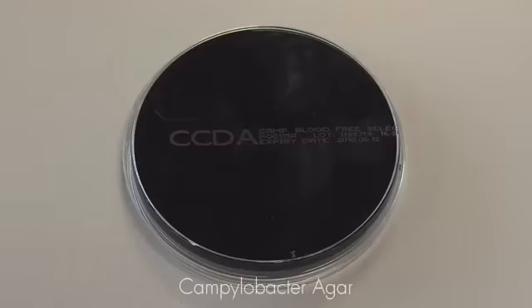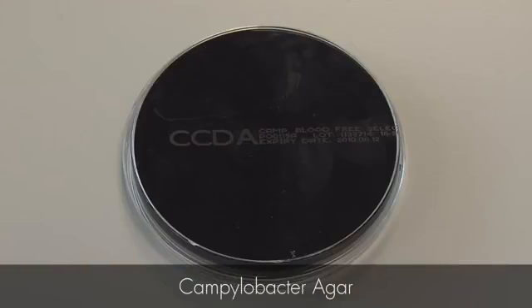An example of this is Campylobacter media. Campylobacter is a genus of bacteria which causes gastrointestinal infections. This media is made selective as it contains a cocktail of antibiotics. Of course, the choice of antibiotics is important. The microorganism we are looking for needs to be resistant to the antibiotics used so that it will grow on the medium, while other microorganisms should be sensitive and therefore would not grow.